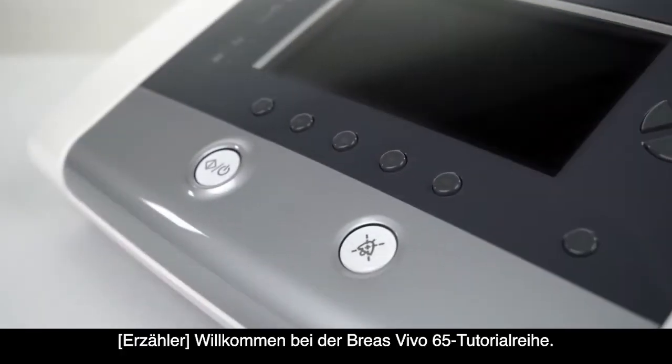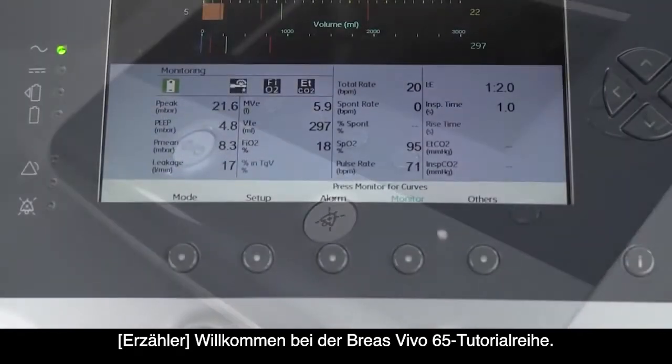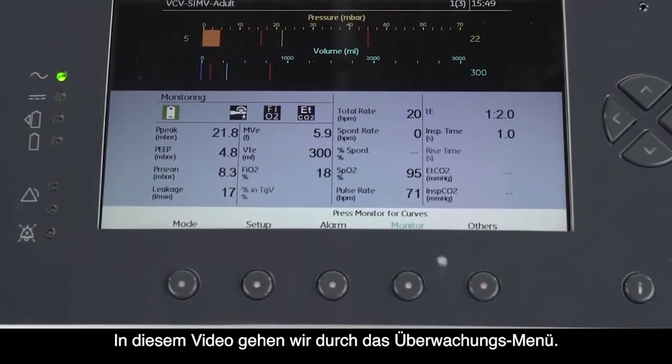Welcome to the Breas Vivo 65 tutorial series. In this video, we will be going through the monitoring menu.